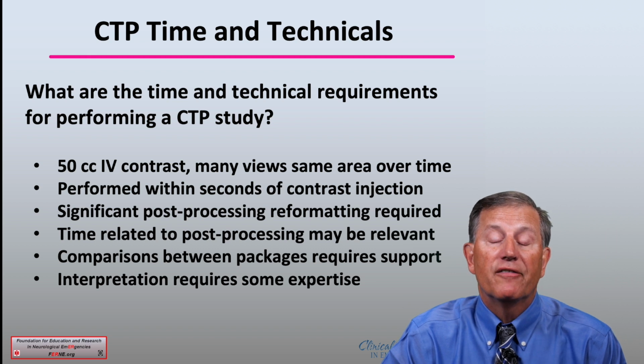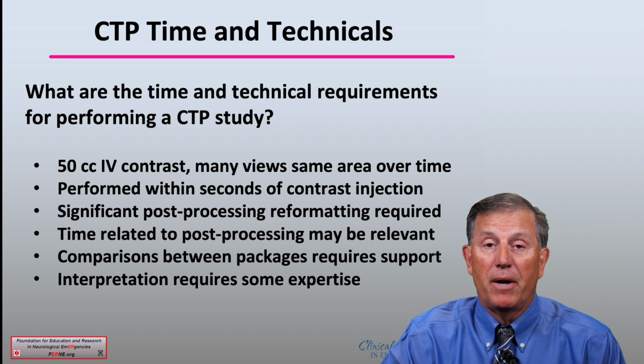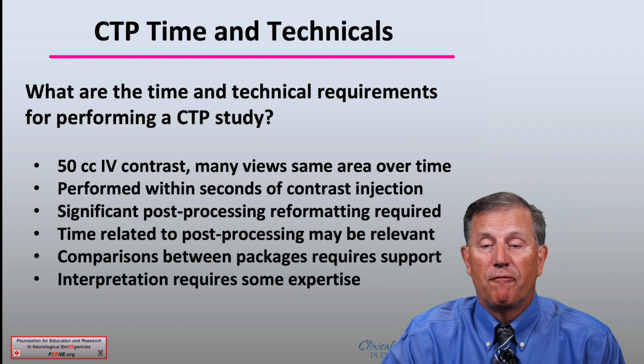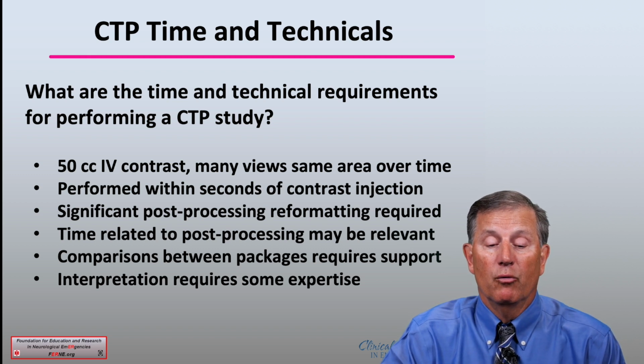It requires significant post-processing reformatting to be done. The time related to this post-processing may be relevant. That is, it might be long enough that there would be a delay in a CTP, even if the CTA results are present. It does require some comparisons between packages that do this testing for the radiologist and the tech. And the interpretation by the radiologist does require some expertise and may optimally be done by a neuroradiologist.